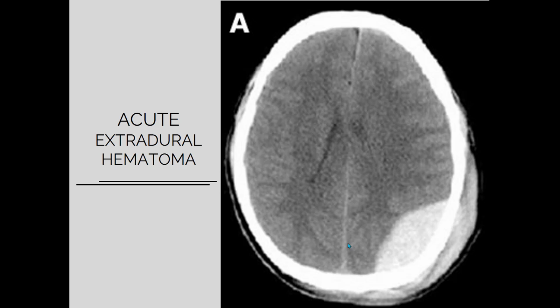Okay, these are measured on the standard CT scan pictures. So we are not providing you the standard CT scan pictures in your exam. So at that level it will be very difficult for you to measure, and if this is a very significant change, then you can write down that there is midline shift.